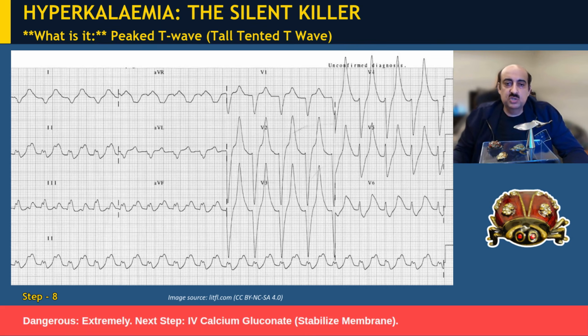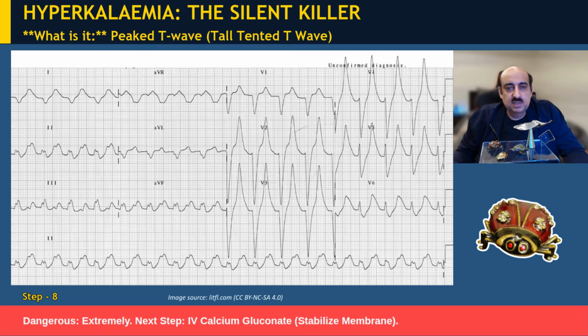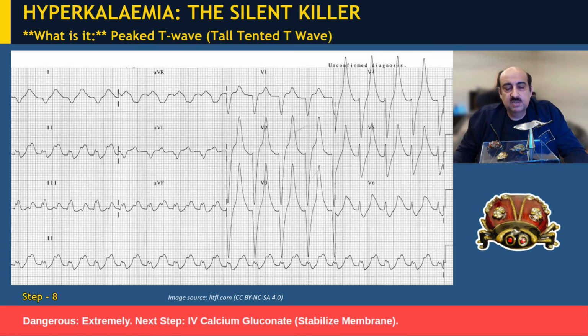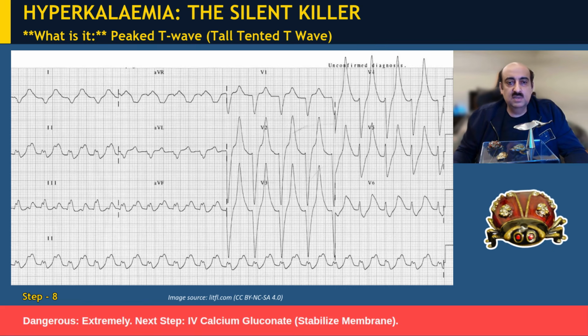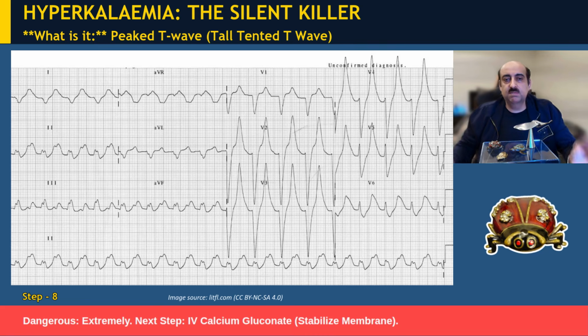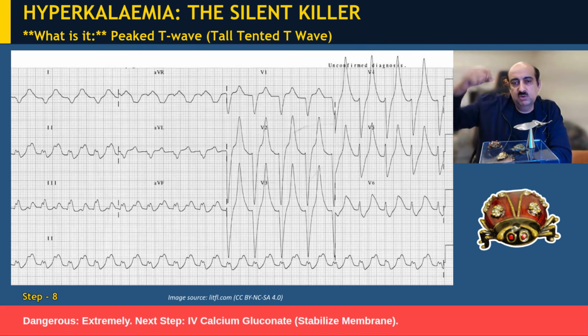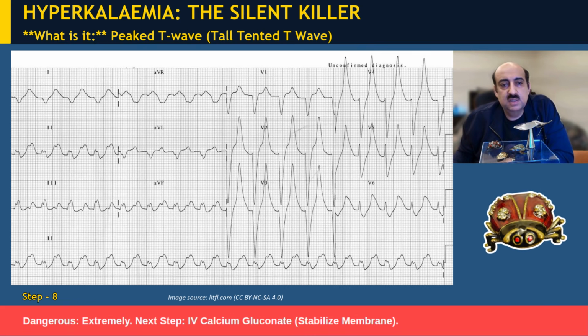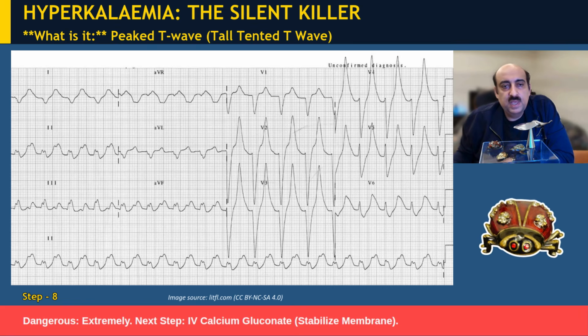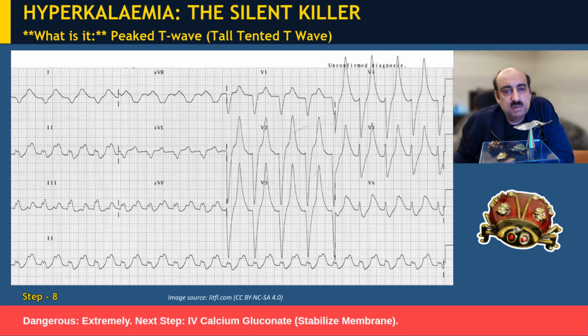This is one of the most startling ECGs for acute hyperkalemia, which is definitely called a silent killer because it doesn't lead to any symptoms on its own unless it's associated with some other secondary pathology. In this situation, you can see the characteristic tall tented T waves, absolutely pulled up like the top of a tent. And you can also see some broadening of the QRS complexes.